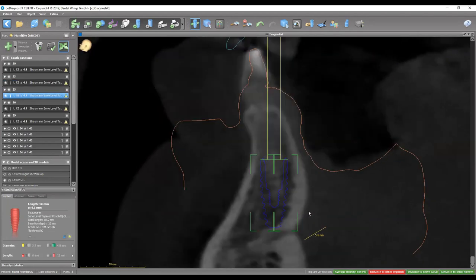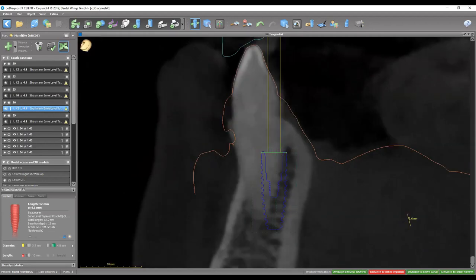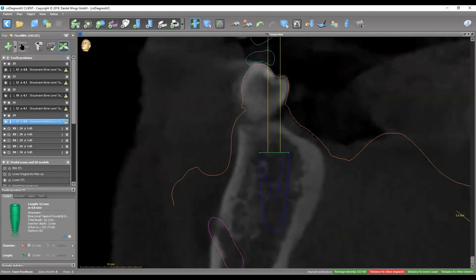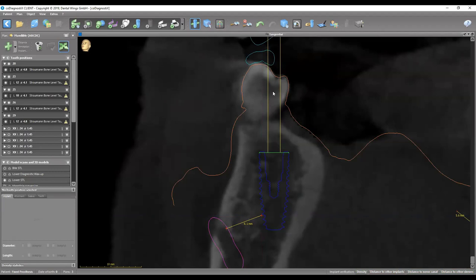The one in the midline of the arch has the lingual foramen — that's why we have a 10-millimeter implant, to try to avoid it. It's a 4.1 by 10 — emergence is out of the cingulum with good bone support on both sides. Then number 29 — the distance from the nerve is more than five-and-a-half millimeters, around six. Really good bone support buccolingually with the same concept of emerging out of the central fossa.